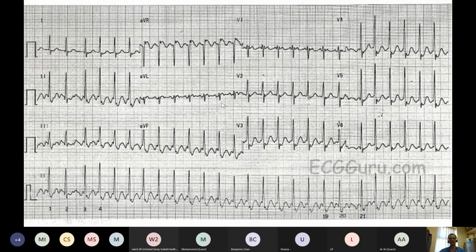If you burn across there, then you block the circuit, it can't form, you cure the atrial flutter. About 95% cure rate, simple procedure, low risk. So we can ablate this very effectively, when it's hard to control with medications.